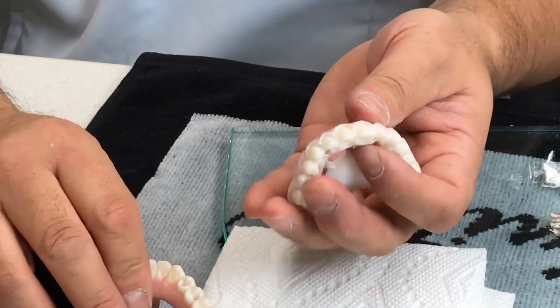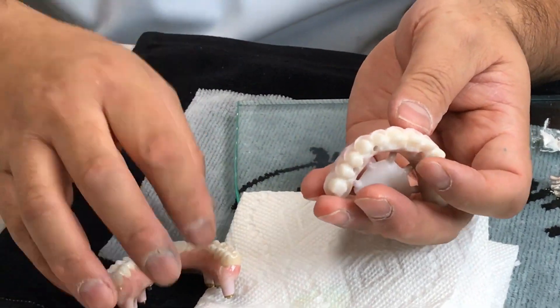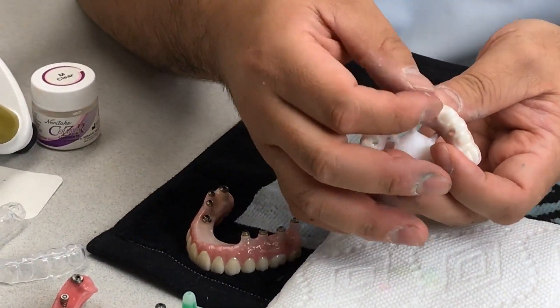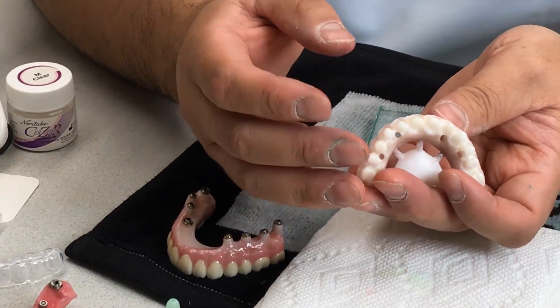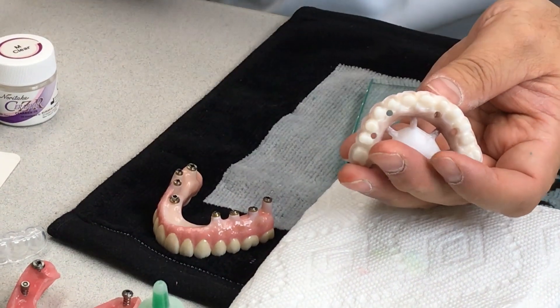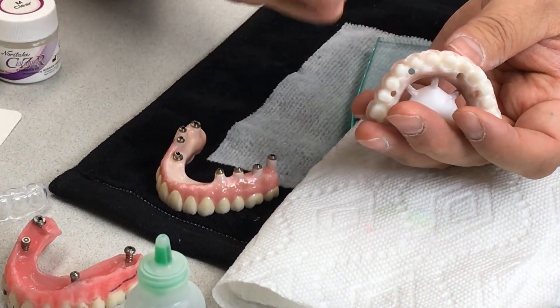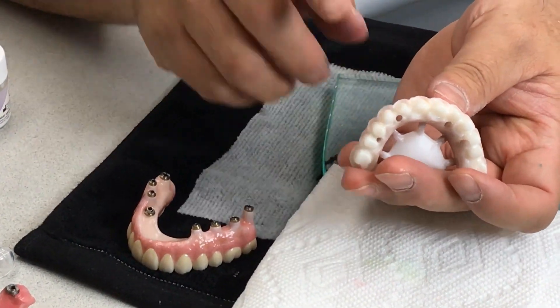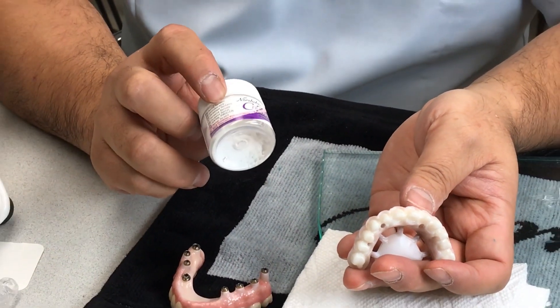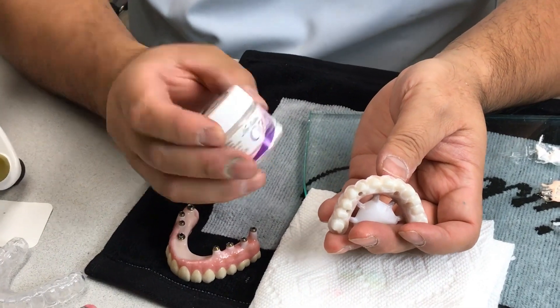Once everything is milled together, we bond the crowns. Sometimes you can use cement in the lab, but I recommend something more permanent and stronger — a proper bonding technique.